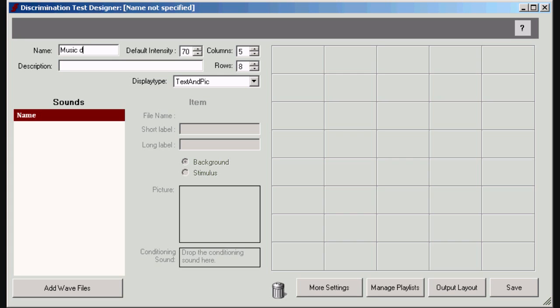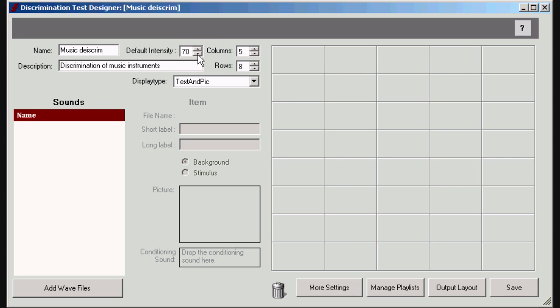Enter the name of your new test and also a description. Set the default intensity. This is the intensity at which the sounds will be presented by default.